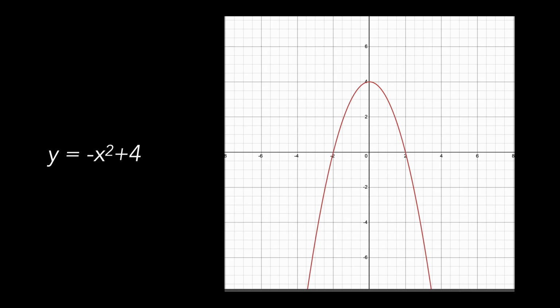And so this is basically simple calculus, doing some integrals to get this. And the way this is done, at least conceptually, is this idea of these stacked columns, right? And so if you basically say, hey, I got a column that's a certain width, certain height, goes up to that line, I can stack a bunch of those columns next to each other, find the area of those columns. That's pretty easy. Add all that up, boom, Bob's your uncle, and we have our area under that curve.